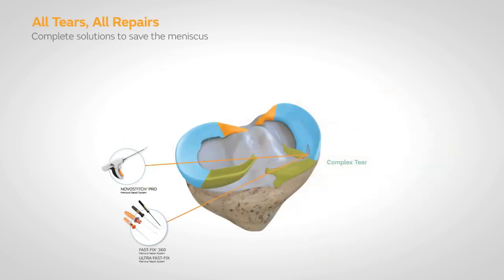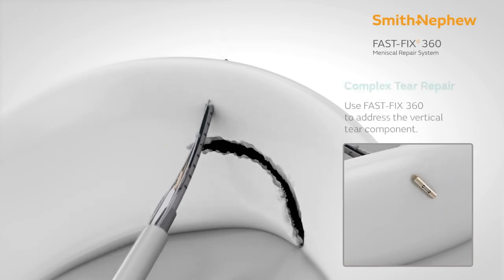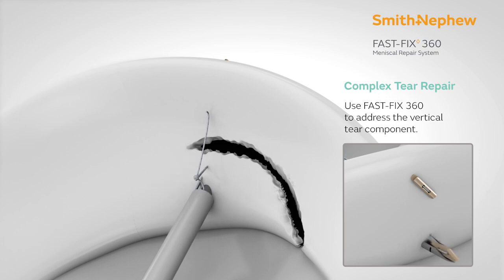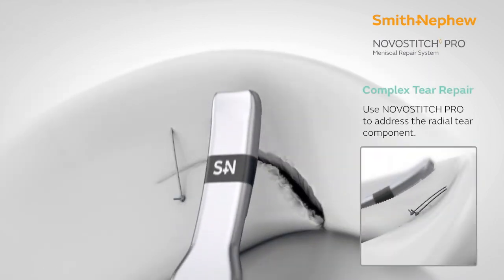All of these techniques are quite advanced, and you can use them in combination. For example, in this particular case we are using the all-inside meniscus repair device FastFix 360 degree for the posterior part of the repair.